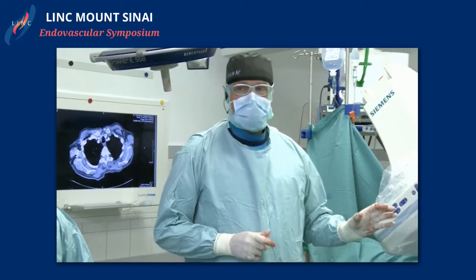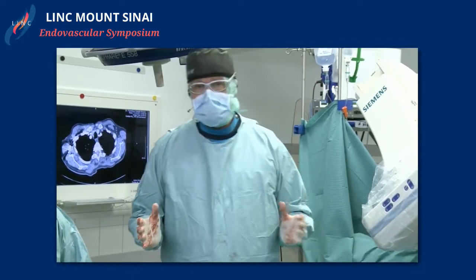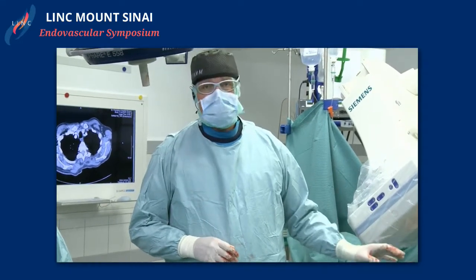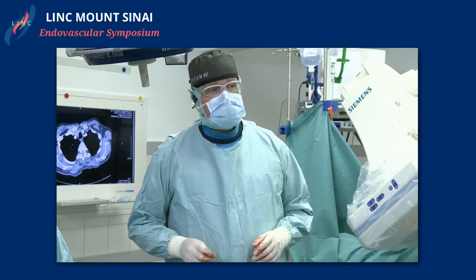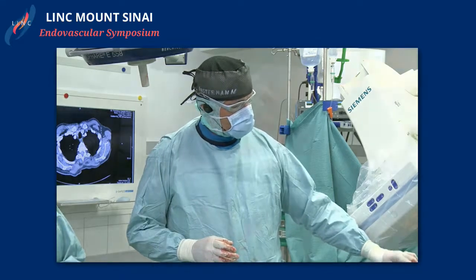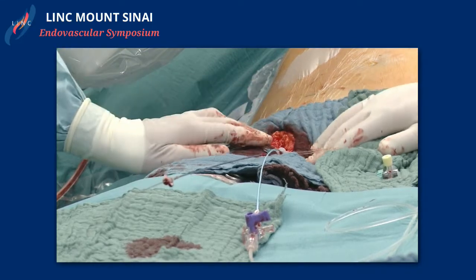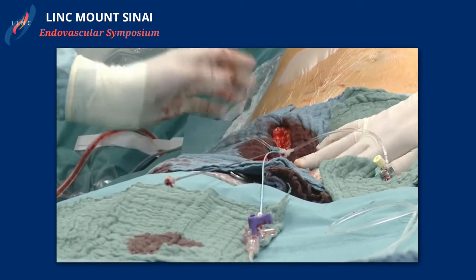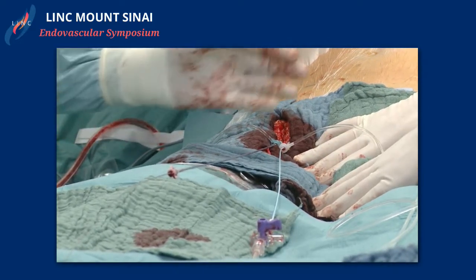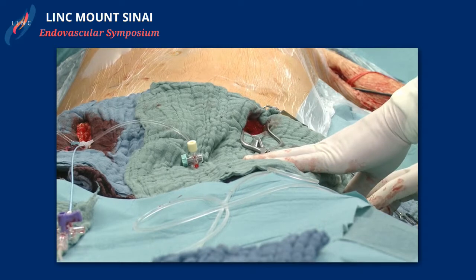What we also need is access for the imaging, and we had only one perfused iliac, and therefore we make 2 cut downs just below the crossover bypass because the SFA is very large. It's about 8 to 9 millimeter, and as you may see here on the right side, we had a small cut down, and we put an 8 French sheath at the moment, and a little below a 5 French sheath for imaging.